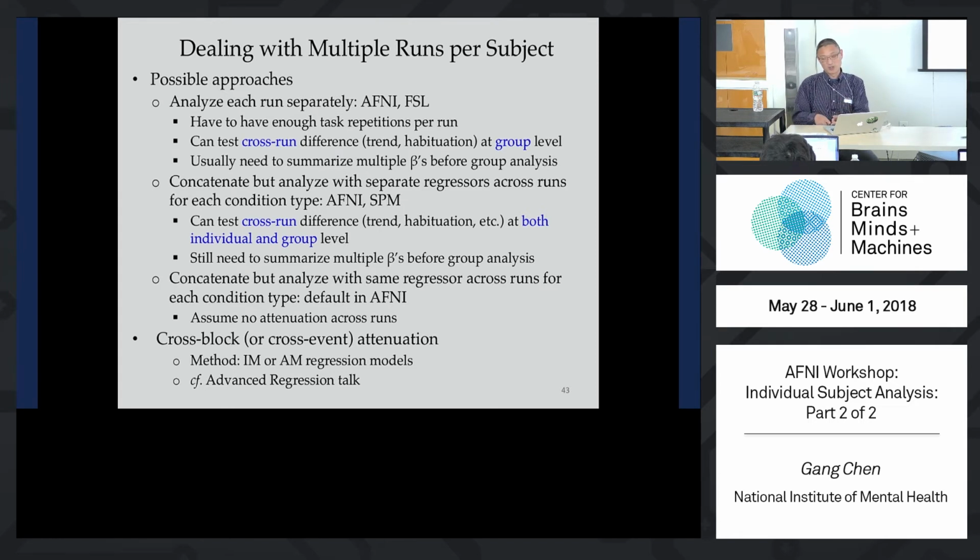in the neuroimaging field, that's why I prefer to call it individual subject analysis versus group analysis. But some people call it first level analysis versus second level. I believe that's SPM terminology. But in FSL, they call the individual subject analysis the first level. Then, because of multiple runs, they have to average those runs, and they call that the second level analysis. So the group analysis for FSL would be called the third level analysis. It's a pretty messy situation. So that's why you really should avoid using first level, second level, or third level. I just say individual level and group level.